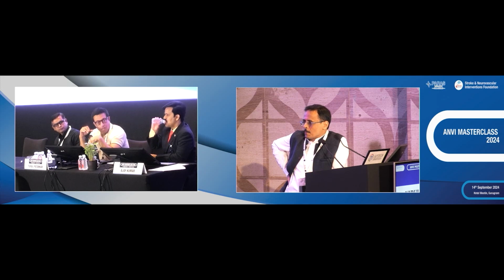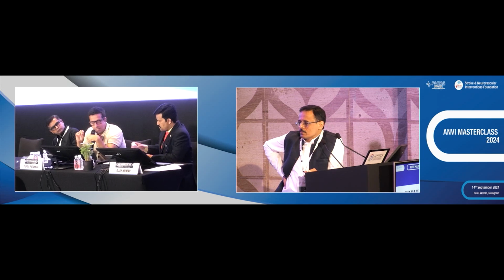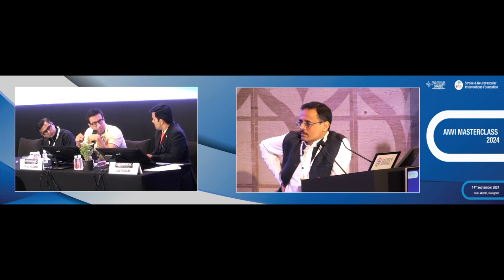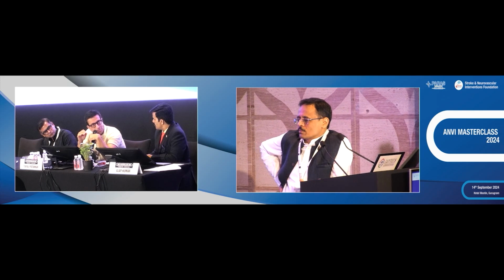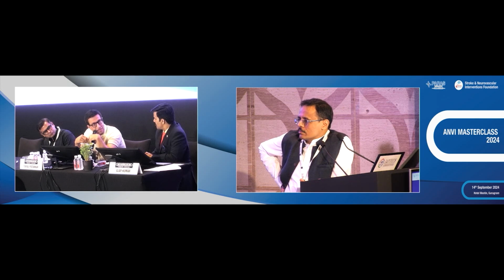Yeah, to fail. The only thing I think we need to be careful about when you get an ICAD is, when you do a stent retriever, like what you did here, you potentially have a risk of rupture because you potentially have a stenosis. I had a rupture very recently. Have you experienced rupture of the vessel?